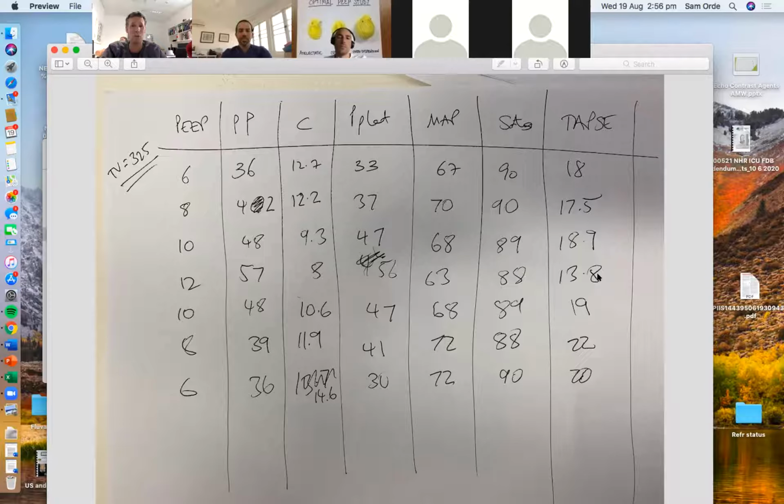And most importantly, this was a dynamic process. The RV responds to changes very, very quickly. And here you can see the TAPSE is coming down into that moderate, getting down to the severe dysfunction phase. I do each of these steps for about 20 seconds, 20 to 30 seconds max, and record the data. Normally it's about 6 breaths and then I record the data.